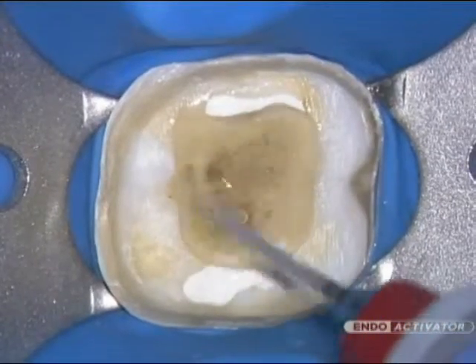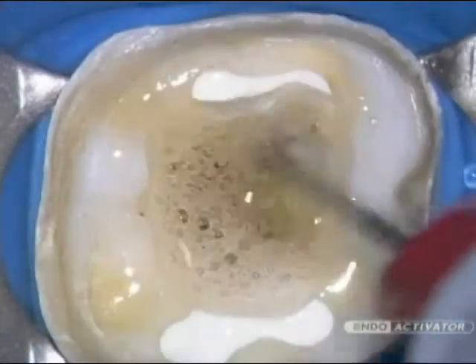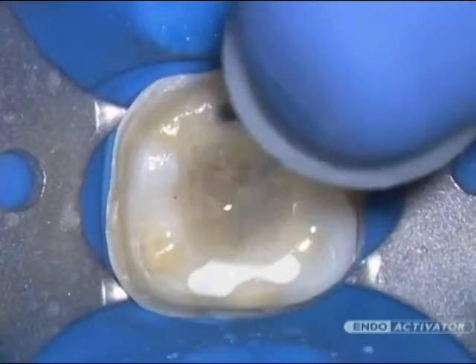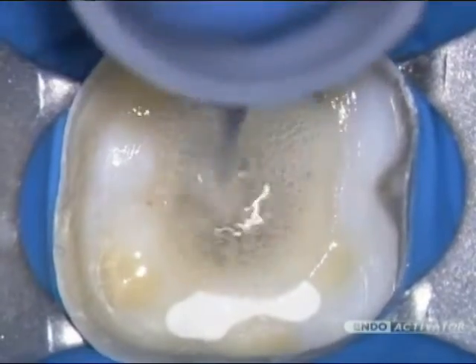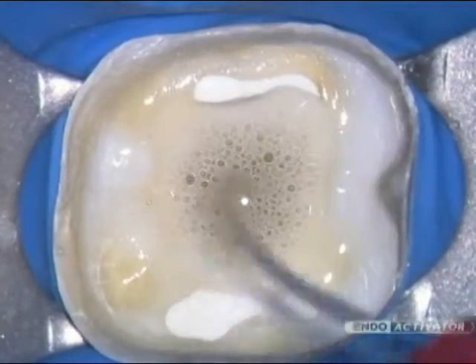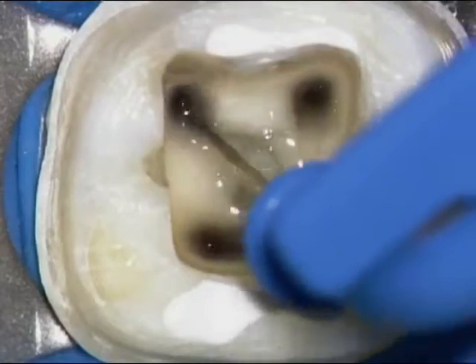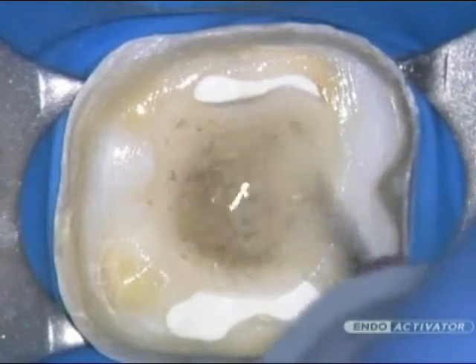In fully prepared canals, select the tip that fits loosely and to within 2 millimeters of working length. Move the vibrating tip up and down in short 2-3 millimeter vertical strokes to optimize a powerful hydrodynamic phenomenon. In general, use 10,000 cycles per minute to encourage debridement and promote the disruption of the smear layer and biofilm. During cleaning procedures, agitate the intracanal solution for 30 to 60 seconds, then irrigate and use intracanal suction to remove loose debris. This process should be repeated for each intracanal irrigant used.